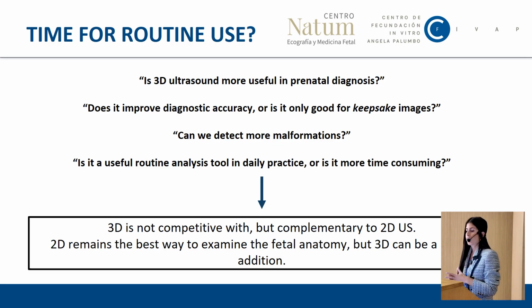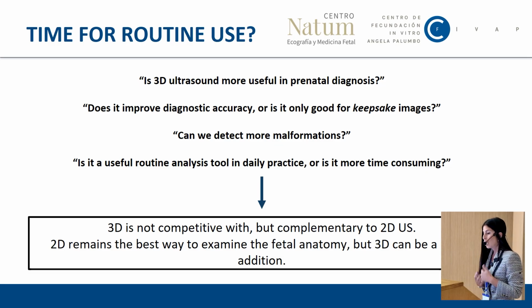Well, 3D and 4D ultrasound expands the diagnostic possibilities in prenatal diagnosis and provides the operator with additional information compared with 2D ultrasound. It also offers a detailed demonstration of fetal defects, both to other physicians and also to the parents. The question of the value of 3D and 4D in routine scanning or as a screening mode remains unanswered, unfortunately. It is important to know that nowadays 3D and 4D ultrasound does not replace 2D ultrasound. 2D remains the best way to examine the fetal anatomy, but 3D is a very useful addition.